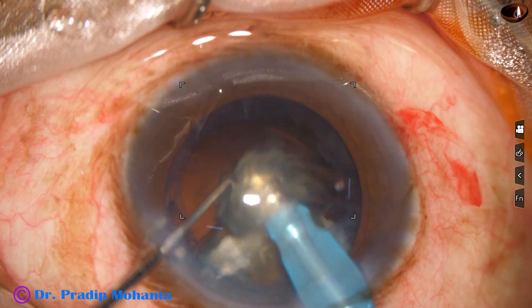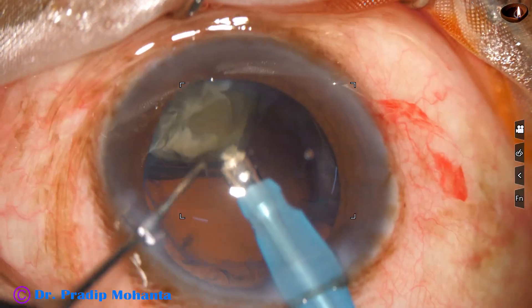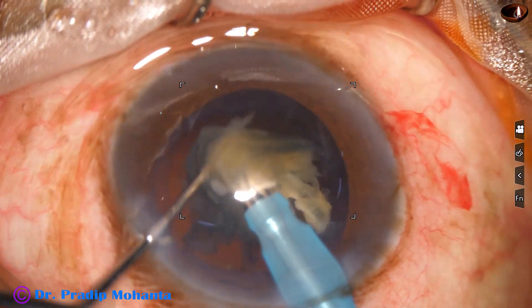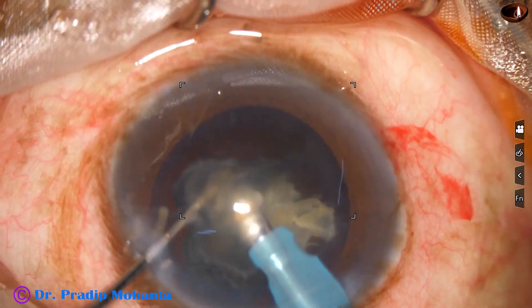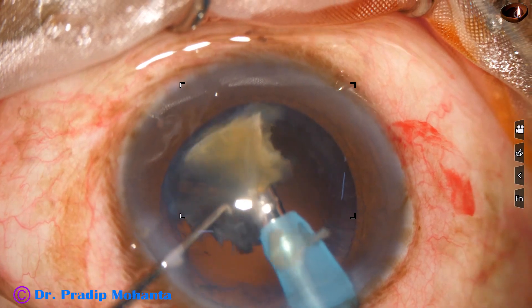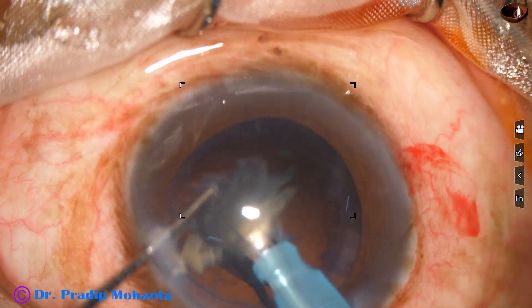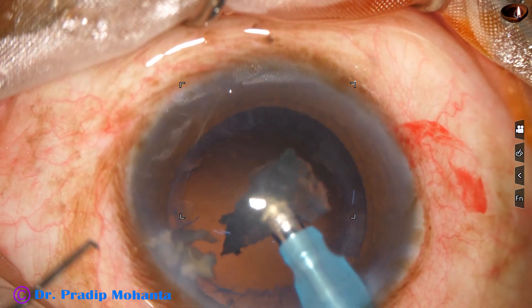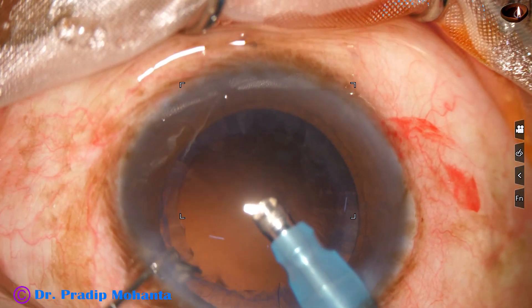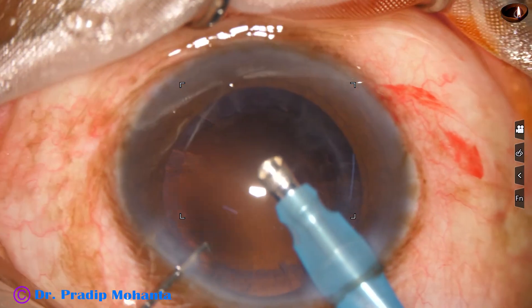One nuclear piece is again subdivided into two smaller pieces, and this is the last chunk of nucleus — it is subdivided into smaller pieces. During emulsification of the last fragment, the parameters are reduced. So far the ultrasonic energy was 85%, fluidics was 45, and vacuum was 450 mmHg. During emulsification of the last piece, vacuum was reduced to 250 and fluidics to 25.